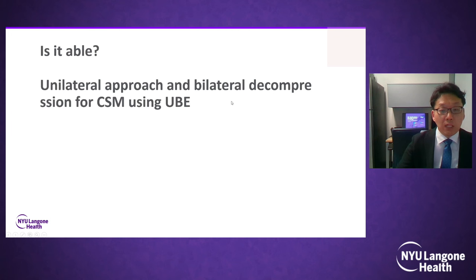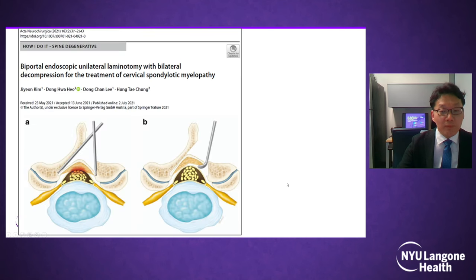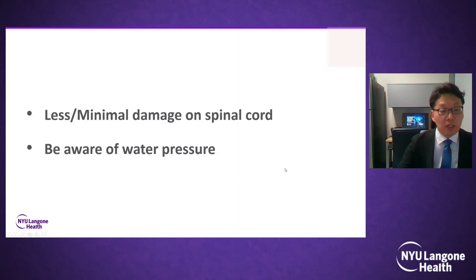And the next step is cervical ULBD: unilateral approach and bilateral decompression for cervical myelopathy by the UBE technique. Is it feasible? Yes, it is feasible. There are many steps in the ULBD technique, and there is also introducing literature.